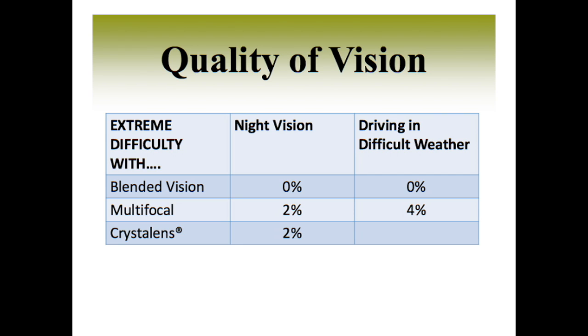Now, I'm hesitant to say 100%. I'm sure there's somebody who might have some trouble, but we just haven't seen it when the targeted goal of the end prescription, the dominant eye set for distance and the non-dominant eye set for the computer, when that's reached, 100% is what we've seen. And remember, in those occasional cases where that's not obtained, that could always be perfected with laser vision correction afterwards.